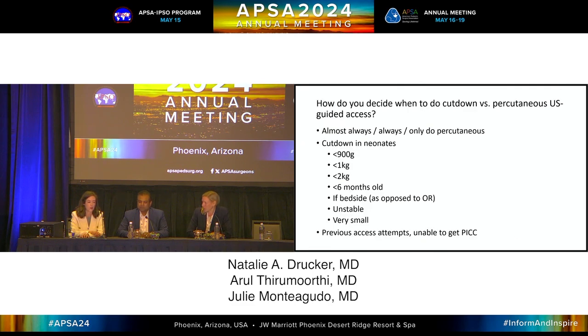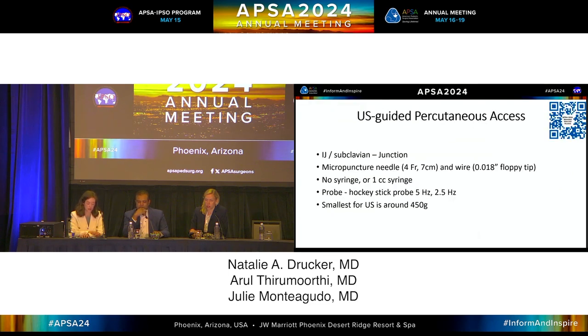And then when you're deciding between doing a cut down or a percutaneous access, what are the factors that make you decide to do a cut down? This was free text, people were writing in their responses, but in general, it seemed that size was the major criteria that people used to make the decision between doing ultrasound guided or cut down. So, Arul, I think you have some techniques to tell us about ultrasound guided access.